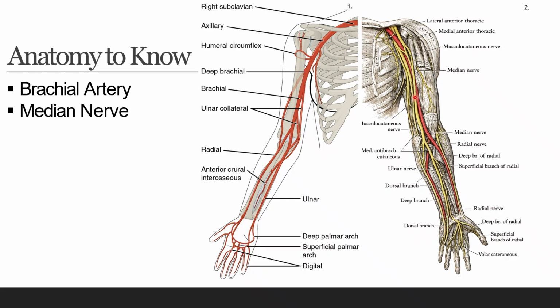As you move more distally, they get a little bubbling, honeycombing type appearance, where you get hypoechoic to anechoic circles inside of them, with a surrounding hyperechoic periphery, and as you slide up and down, that little bubbling can change and shift. As opposed to the muscles: when you're in short axis, you'll be looking at almost little tiny white lines that vary as you slide down the muscle. If you get in longitudinal axis and slide across it, you have these shifting linear hyperechoic lines, and this is all called anisotropy. Just a little thing to be aware of if you accidentally slide over the side.